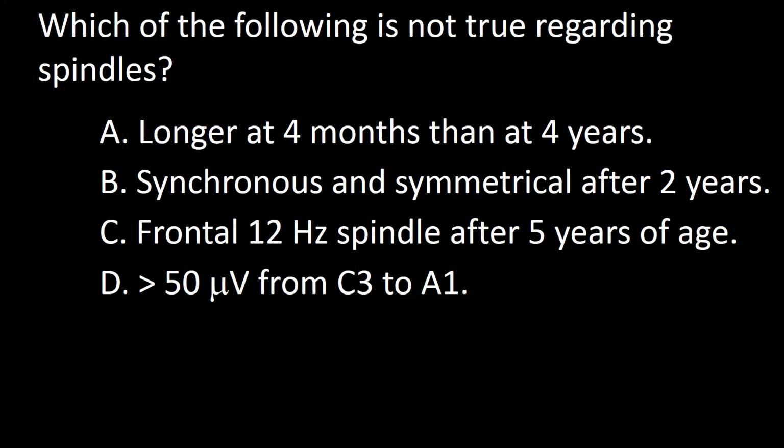A. Longer at 4 months than at 4 years. B. Synchronous and symmetrical after 2 years of age. C. Frontal 12 Hz spindles after 5 years of age. D. More than 50 microvolt from C3 to A1.